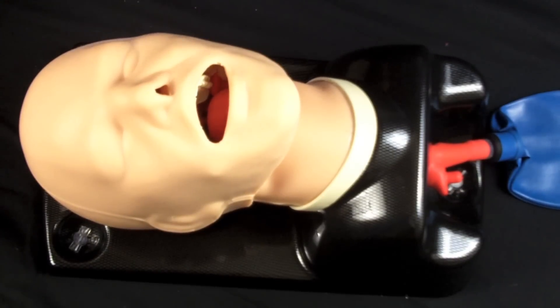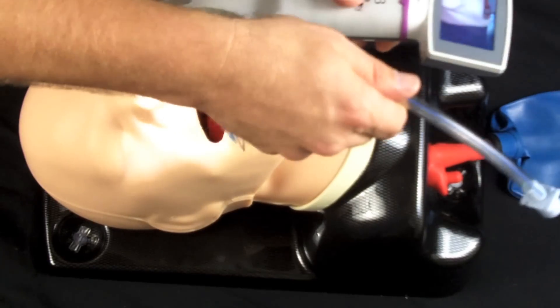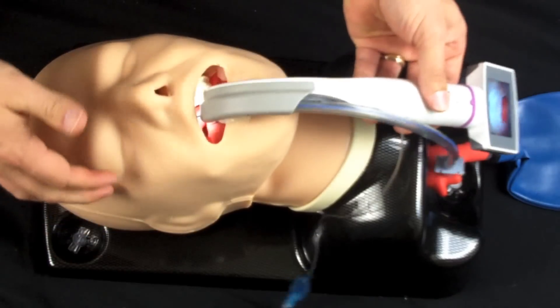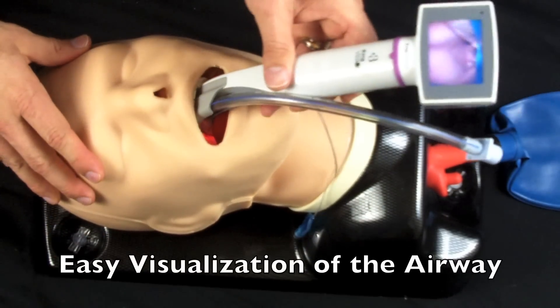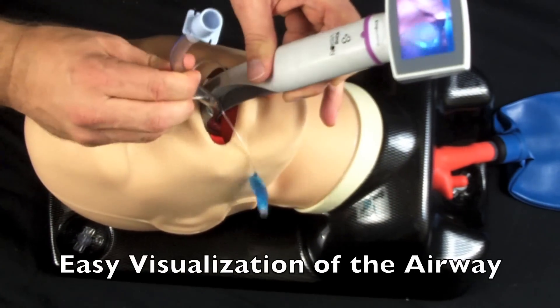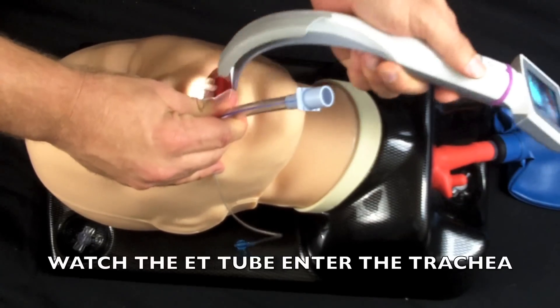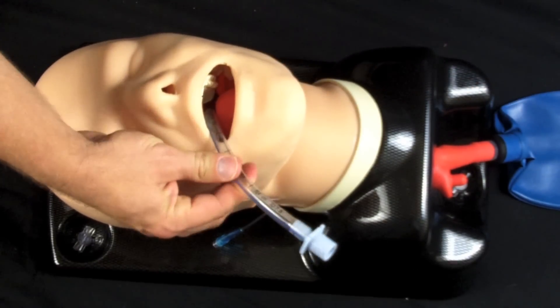Now I'll show you how quickly you can facilitate an intubation using the King Vision Video Laryngoscope system. Load your ET tube, and there you go.